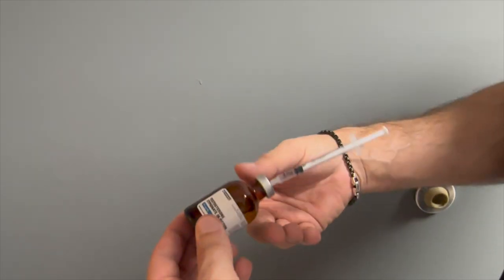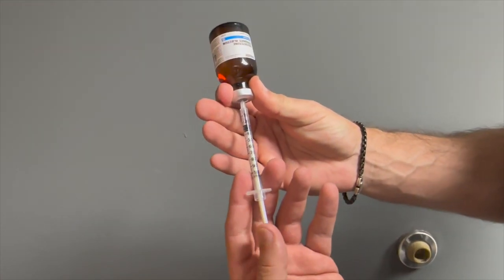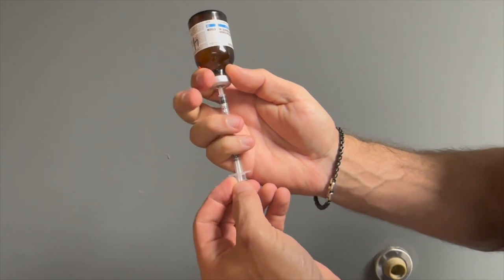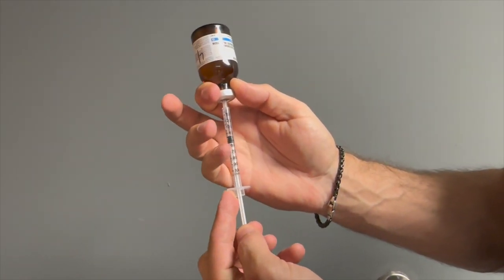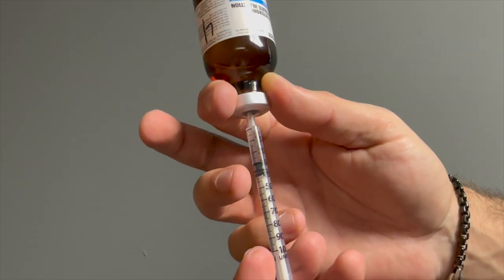Next, turn the vial and syringe upside down, ensuring to secure the two together to avoid bending the needle. Draw back on the plunger to create a vacuum inside of the syringe, allowing the testosterone in the oil to draw into the syringe. This may take up to 30 seconds depending on your dose.